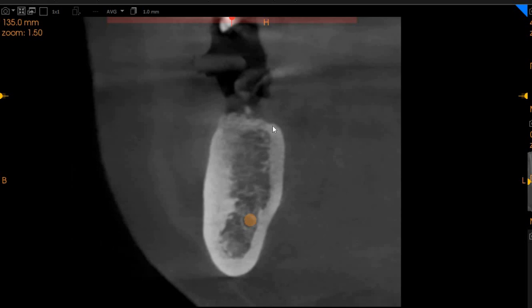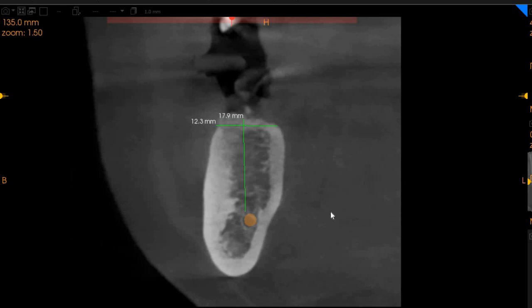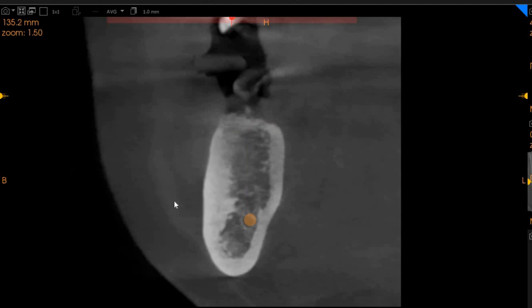It can be done so well because we've got D2 quality bone — very nice, rich bone, approximately 12mm of it, with a good 17–18mm of height to the inferior alveolar nerve. We've got D2 quality bone, excellent cortical plate, excellent cancellous bone. So everything here is absolutely wonderful.